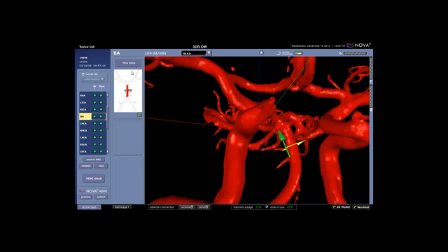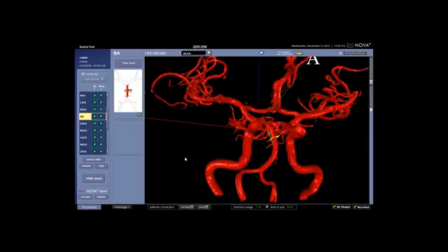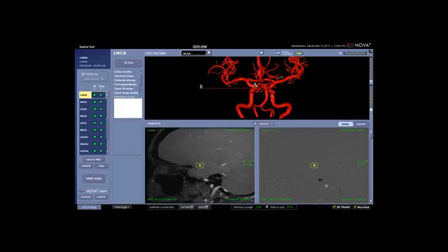The next screen is where I can take a snapshot, a picture that I want to go on the report. So I'll just save that image, and I'm done. So as you see, the processing is automatic. The report is automatically generated. So I am simply doing a quality check to make sure the patient hasn't moved and my images meet my criteria for an accurate measurement: perpendicular orientation of my scan and laminar flow.